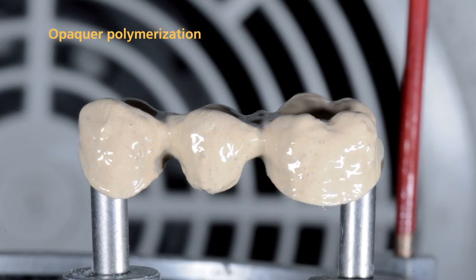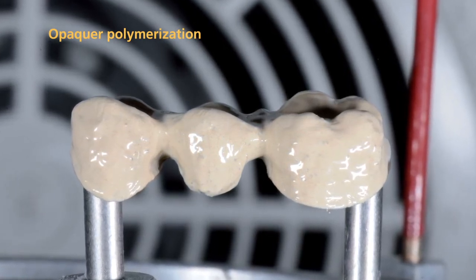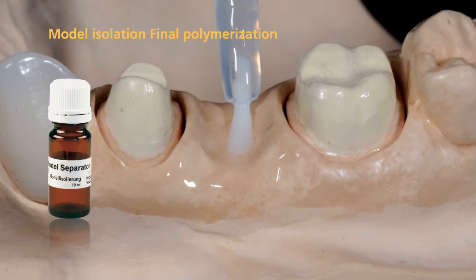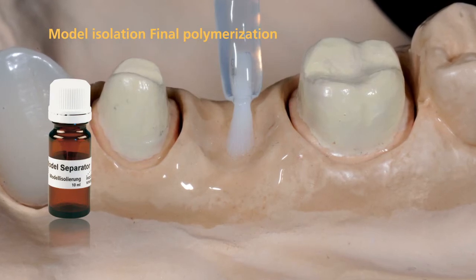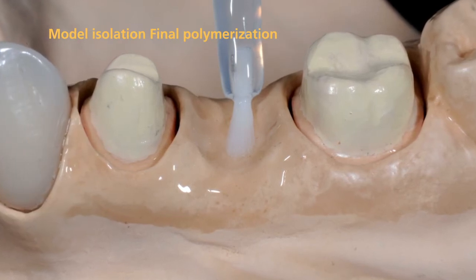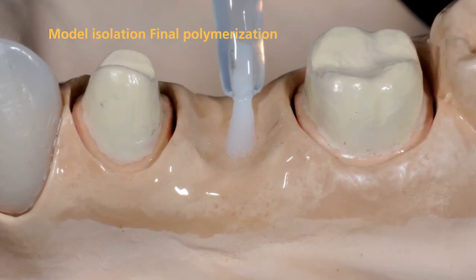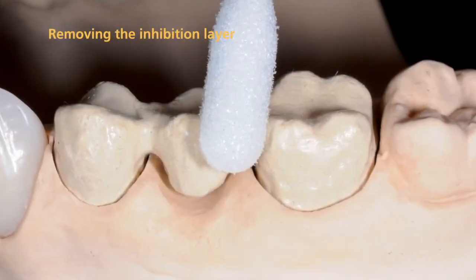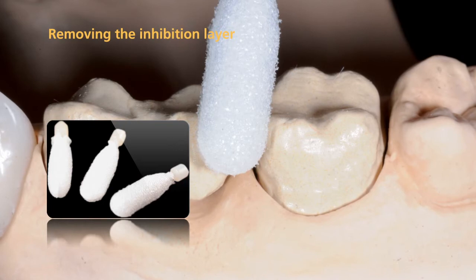Conduct the final polymerization of the opaquer in a Lumamat light furnace for 11 minutes using program P2. Isolate all areas of the model which may come into contact with SR-NEXCO before you begin the dentin and incisal layering procedure. Use SR model separator to seal these areas. Apply the material in a thin coating, allow it to react for a short time, and remove excess with oil-free compressed air. Thoroughly remove the resulting opaquer inhibition layer with a disposable sponge and make sure that the opaquer surfaces are free of residue.